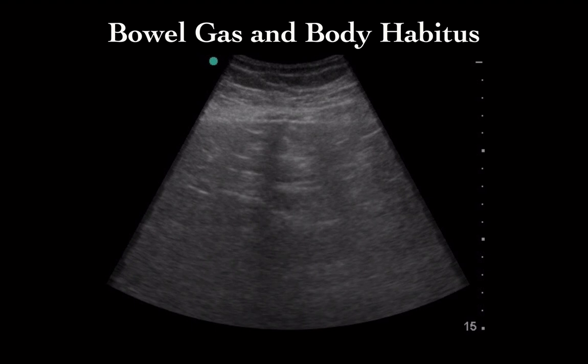Now, what you'll run into frequently is that people are obese, and that is certainly a risk factor for the development of a AAA, so those are people we should screen. Remember, distance is our enemy. So it makes it harder to see the artery, the more fat we have to look through. Remember also that air is an enemy to ultrasound. Bone, distance, and air are our enemies.